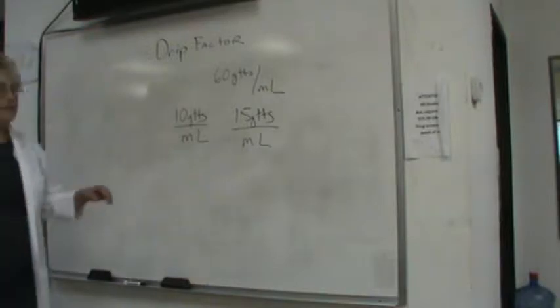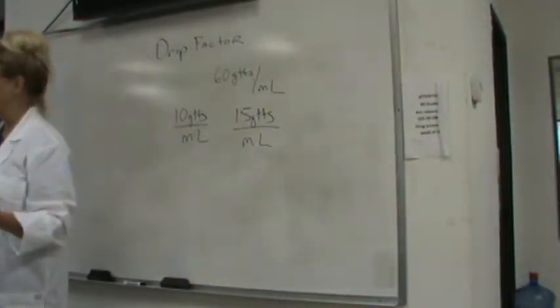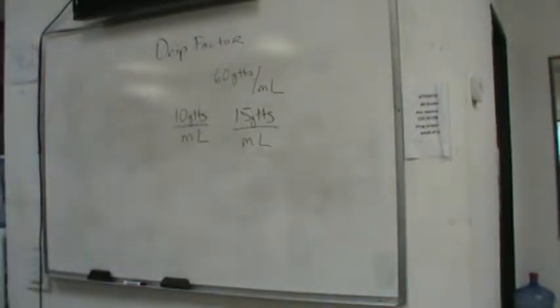Okay, so these are drip rate calculations. We're going to see how these actually apply in just a short second here. I just need to get a bag. IV bag.